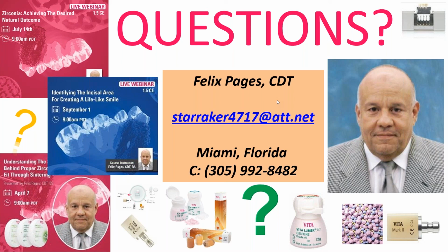And then what I do is I have Graham cutting literally a microscopic finish line on the facial and lingual all the way around. And then I put the glaze on, and it stops at the cusp tips and all the way around the marginal ridges, just below the marginal ridges. So nothing on the occlusal table has glaze because the glaze will wear off. Now, even though this is zirconia, it's much better tolerated when it's highly polished than with a glaze, because the glaze itself can break down and it'll start to wear the enamel.